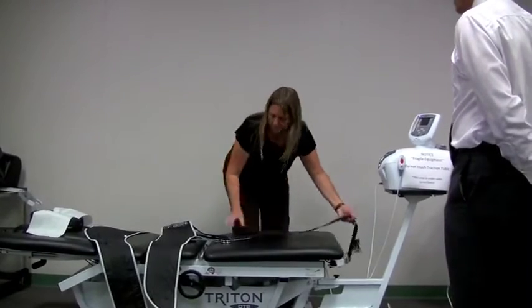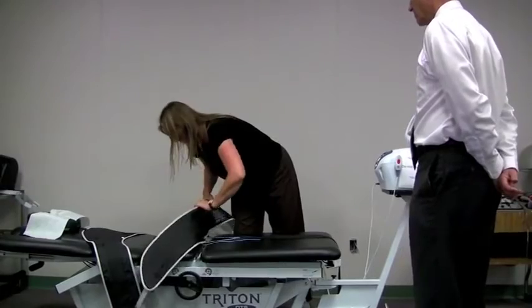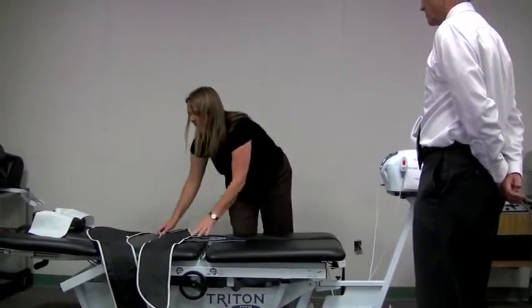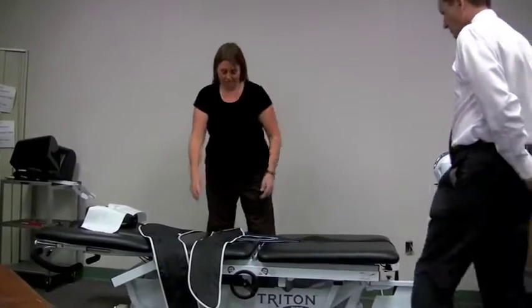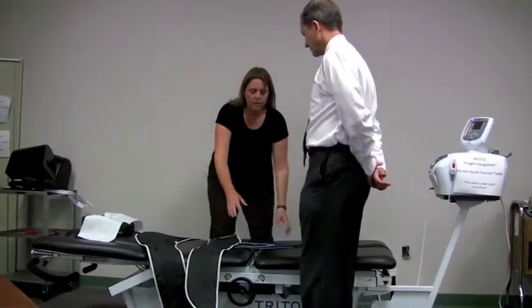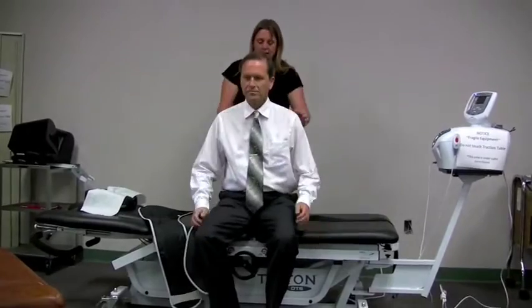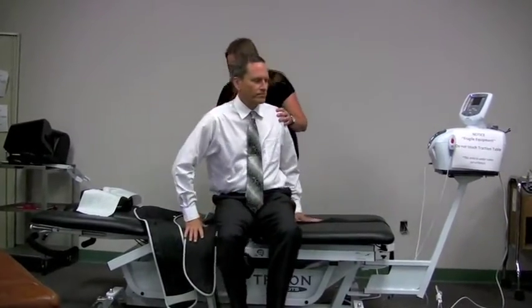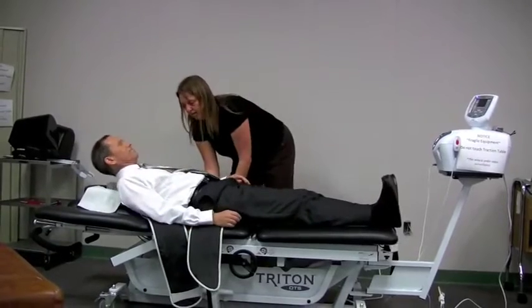Go ahead and have my patient lie on his back. Now, here's the trick to end up in the right position. Come on over here, patient. I'm going to have you sit with your tush so the crack of your butt lines up. Oops, come back up. Keep on going a little bit higher up there. Perfect. Now you're going to turn sideways and lay on your back and try to center yourself on the table as much as you can.